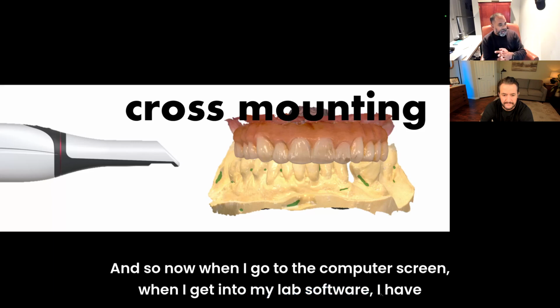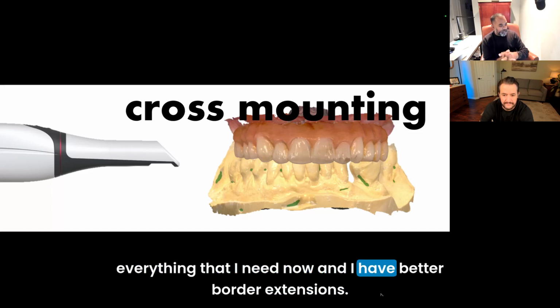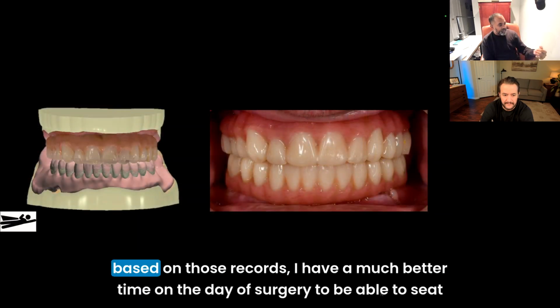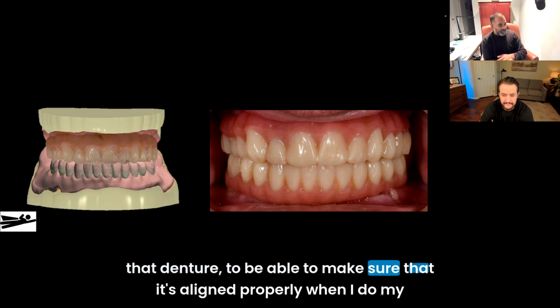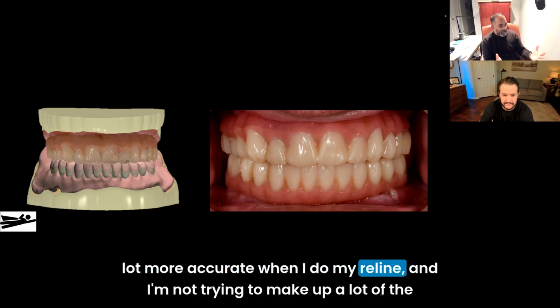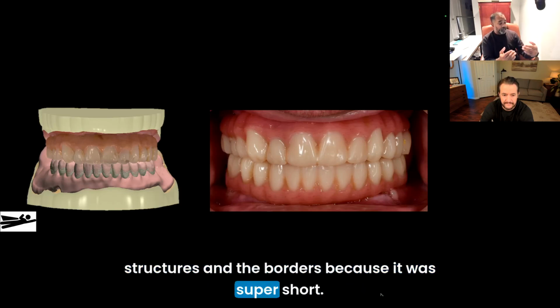And so now when I go to the computer screen, when I get into my lab software, I have everything that I need now, and I have better border extensions. And now when I design a denture based on those records, I have a much better time on the day of surgery to be able to seat that denture, to be able to make sure that it's aligned properly when I do my conversion, or if the patient was just using this as an immediate denture, it's going to be a lot more accurate when I do my reline, and I'm not trying to make up a lot of the structures and the borders because it was super short.